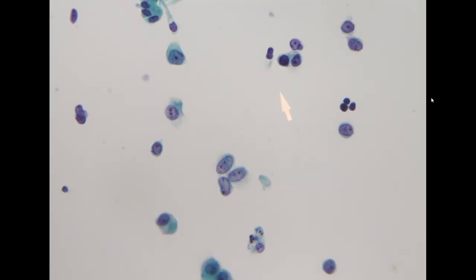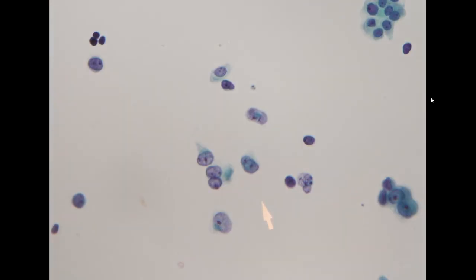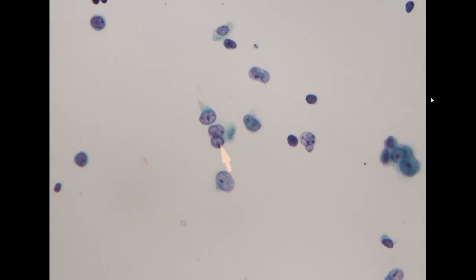For the high-grade urothelial carcinoma, we usually rely largely on the increase of NC ratio. If you see in the background, there will be some single cells with markedly increased NC ratio.